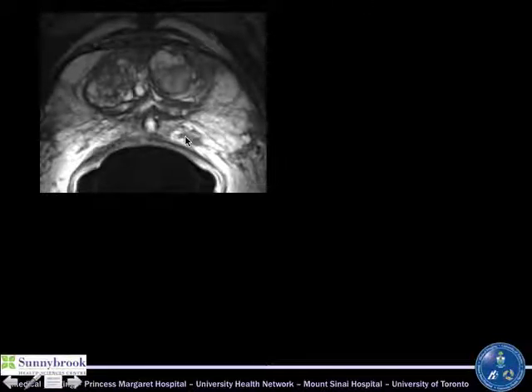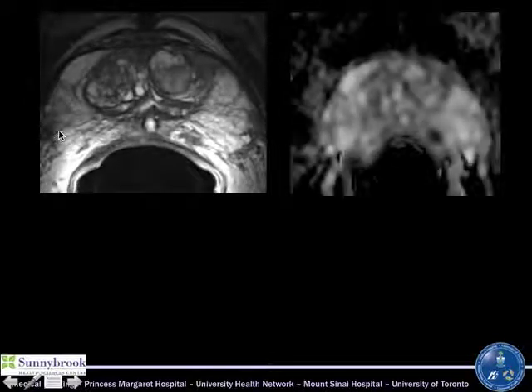So is this a cancer? Is this a cancer? Is this wispy stuff here cancer? How do I tell? So this is an ADC map. This is derived from the diffusion-weighted image. And remember, the lower the ADC, the higher the Gleason score. What we see here is a nice, clearly identified black dot. Not hard to interpret, fairly straightforward. This is actually a relatively low ADC. And so we're concerned about Gleason score 7 components, but a very small focus, right?